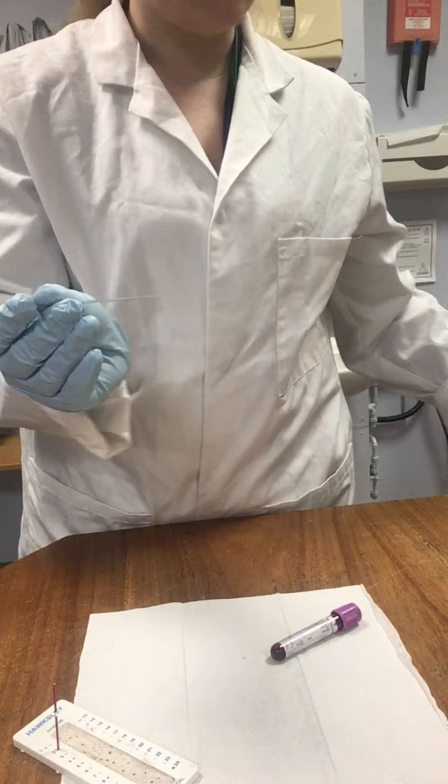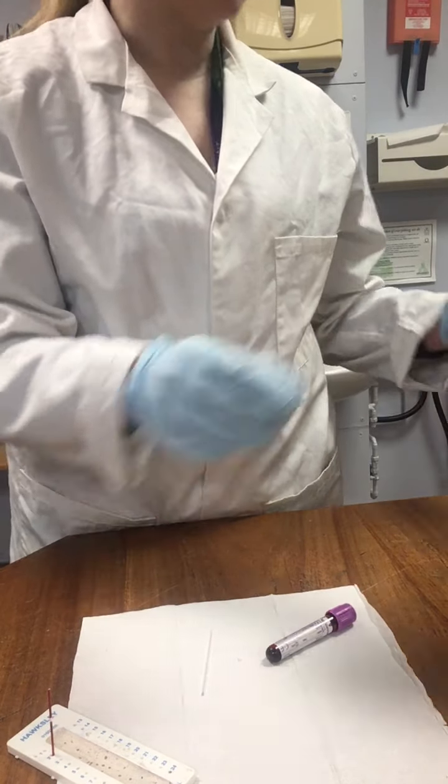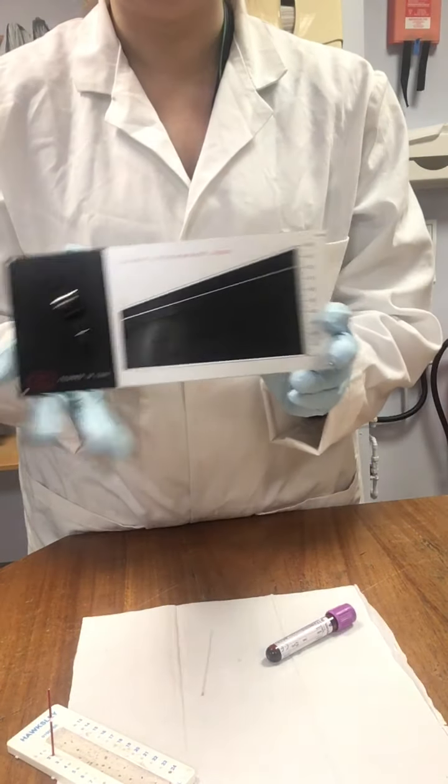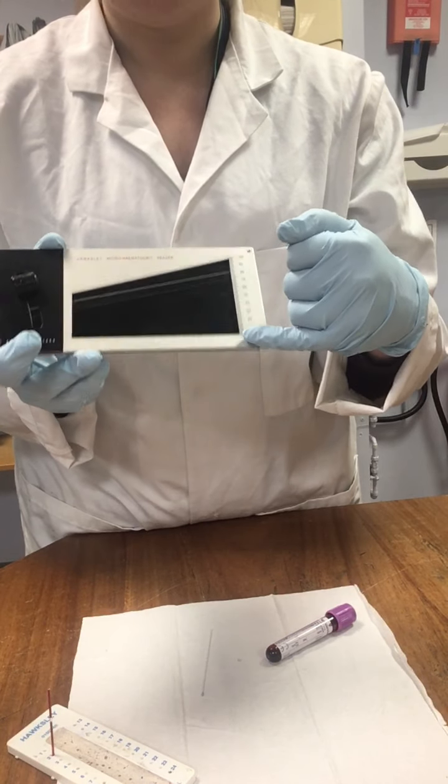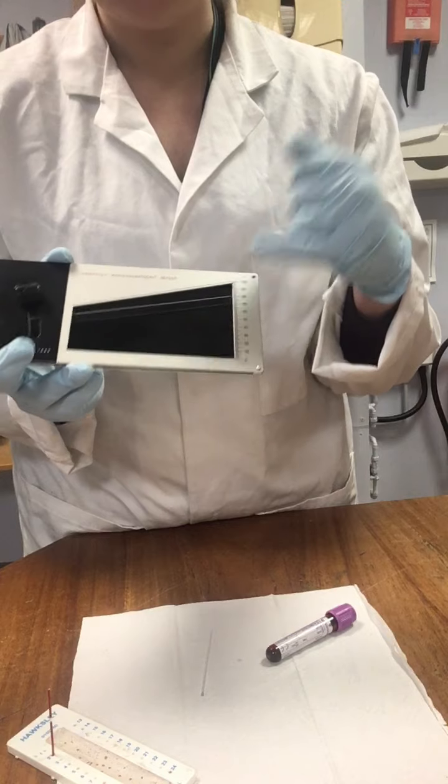Now, for this particular test, we are going to use what's called a Hawksley reader, which looks like this. And as you can see, we have got a scale up the side. So, we want to make sure that we have enough blood to fit that.